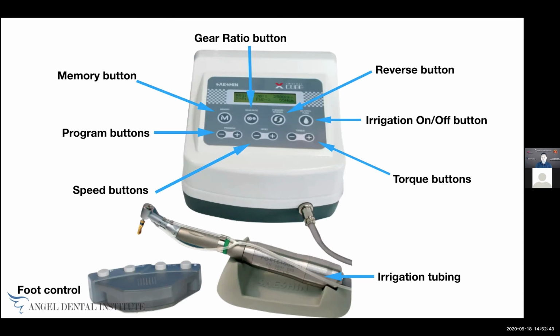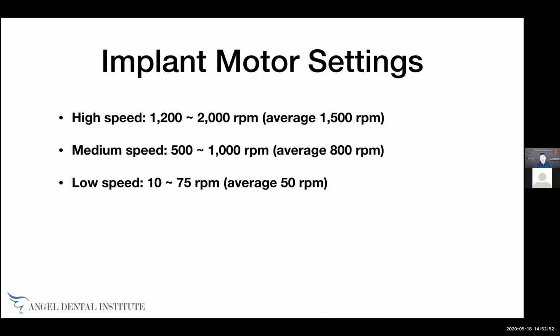And then there's a reverse button, irrigation button, torque button, programming, memory button, and speed control. Implant motor settings. These are the settings that I suggest.